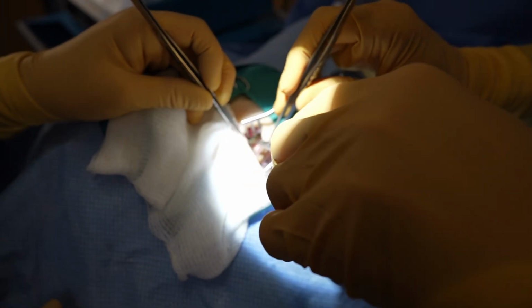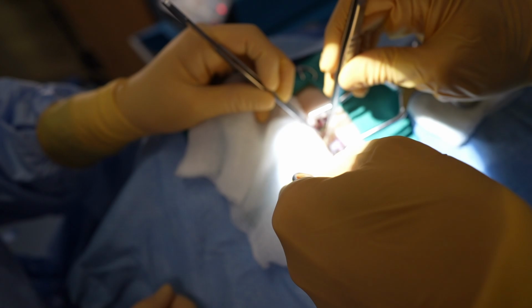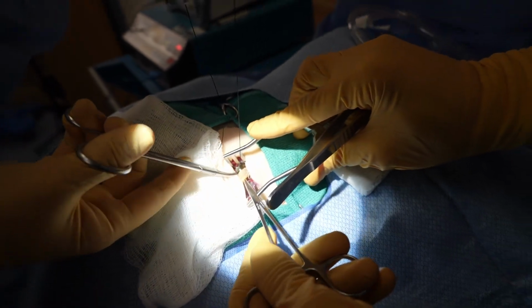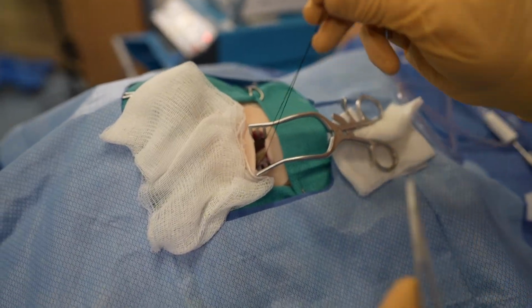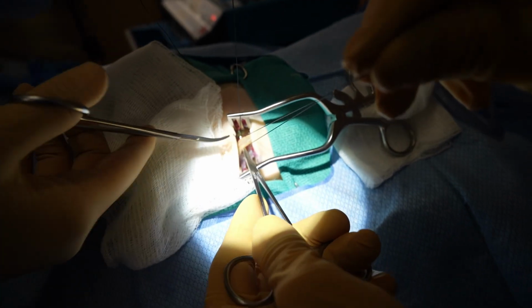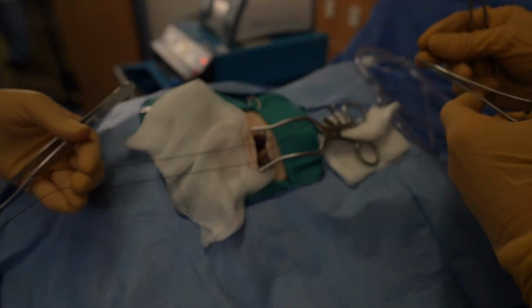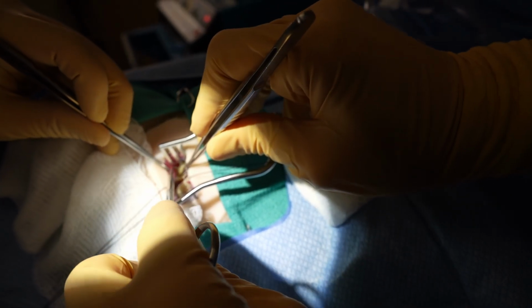Next, we will dissect out the jugular vein very carefully, only grasping the vein once in order to elevate it and dissect underneath. The more times we grasp and release the vein, the more it will cause the vein to vasoconstrict. We then place 2 silk ties underneath the vein in order to attain vascular control. We will snap these ties and place them down on the bed.